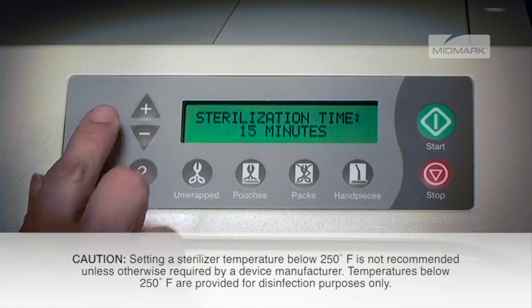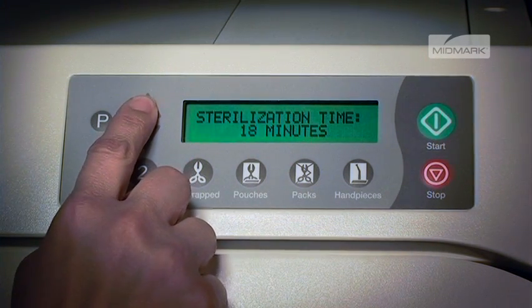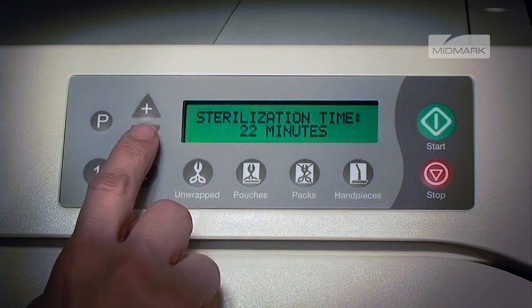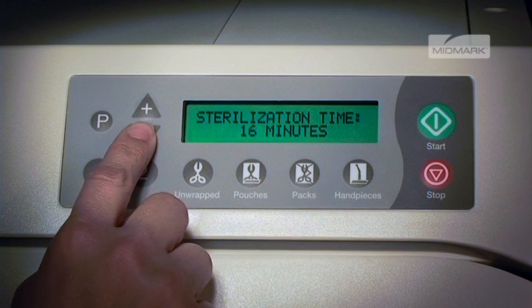Once the P button is selected, the display will show sterilization time and the current value. Then you may press the plus or minus button to adjust the values, followed by P for next, or stop to cancel. By pushing the plus or minus buttons, the sterilization time can be changed from 3 to 90 minutes in 1 minute increments.